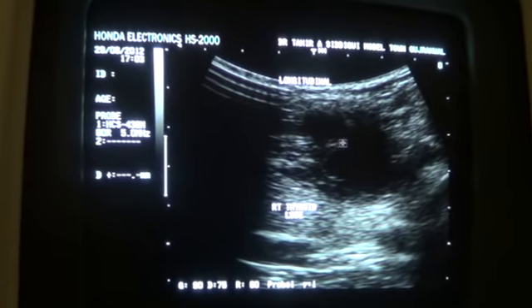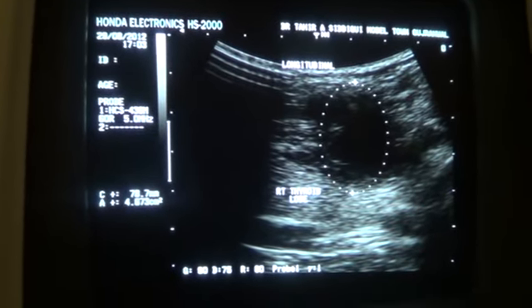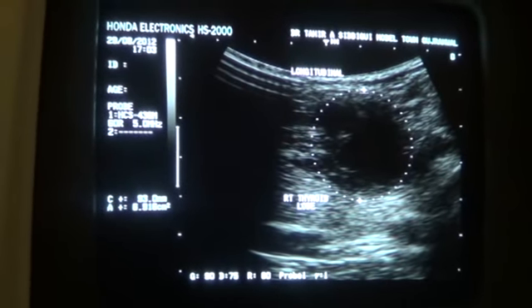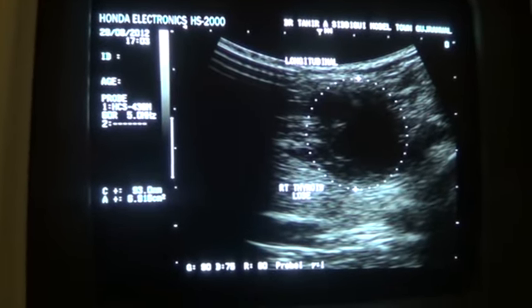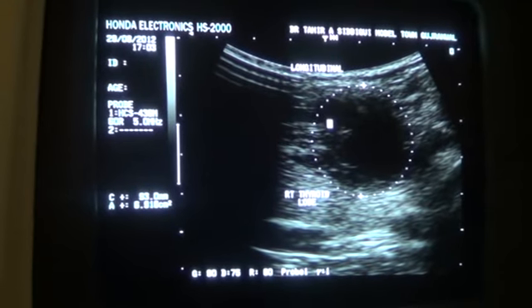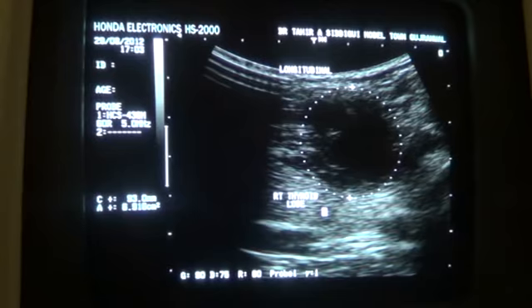This is the cystic area that we were seeing, a bit distorted in this view, because I took this view to show you the remaining thyroid parenchyma, or the parenchyma that is spared by the cyst, has normal echogenicity and the size appears normal.